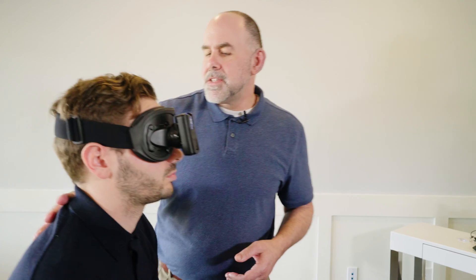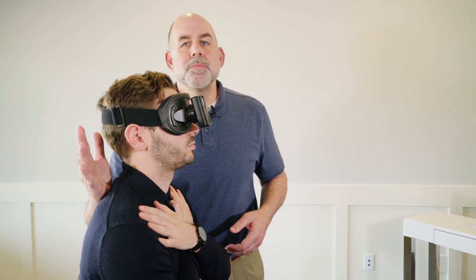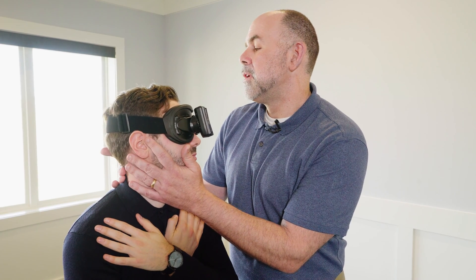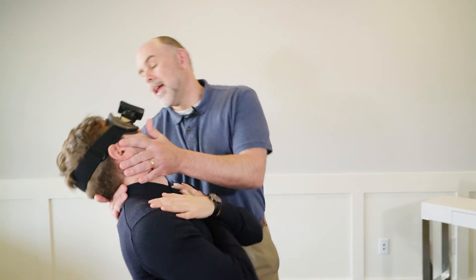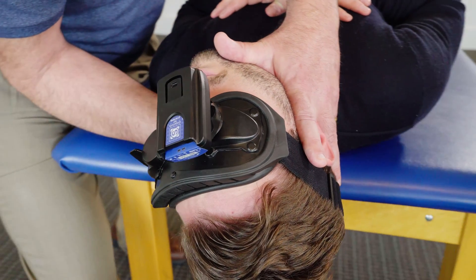To position the patient for the Dix-Hallpike, you're going to first instruct them to cross their arms across their chest. You're going to give them as much support as possible, supporting them from the back and from the front. You're going to turn their head 45 degrees towards you with 20 degrees of extension. On the count of three, I'm going to lie you back — one, two, three — and you lie them back. You're going to hold this position for at least 30 seconds.